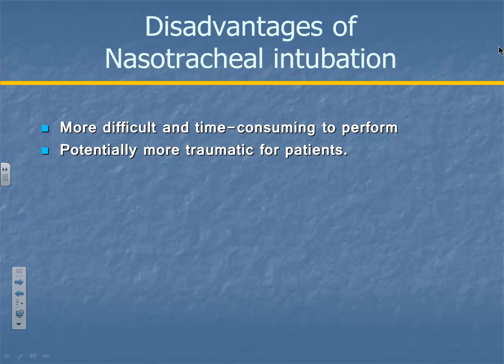What are the problems that the patient may encounter because of a nasal intubation? Think about where that tube is going. Infection, yeah. If you're passing that through the nose, you greatly increase the chances that the patient's going to get an infection from that. What's the other problem with it? One particular problem, besides that? If you deviate your septum, that would be bad.